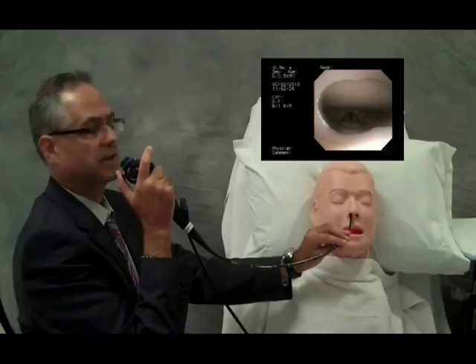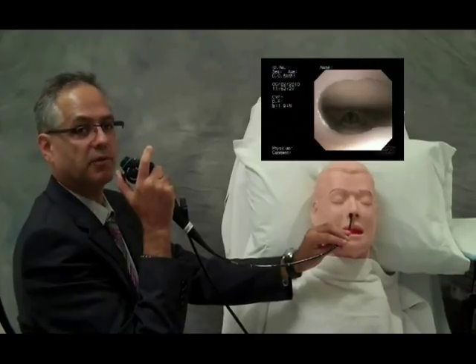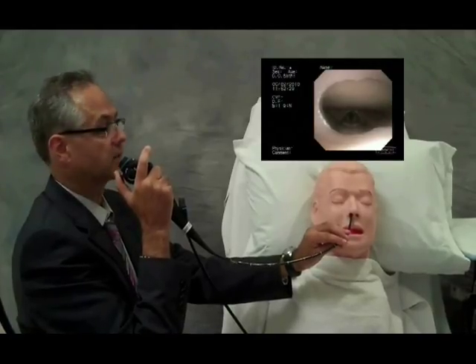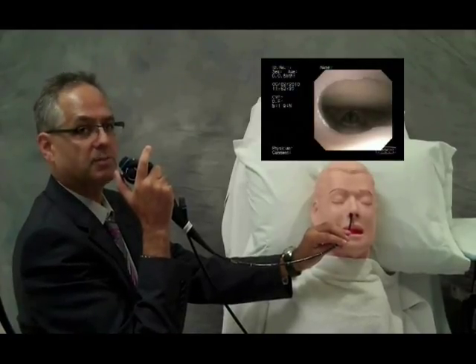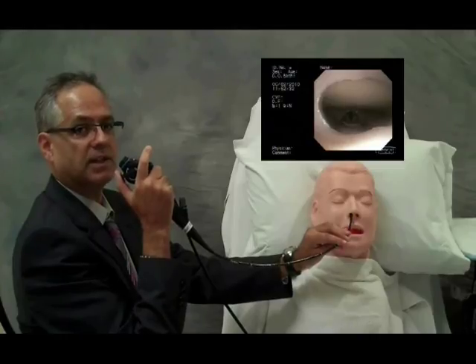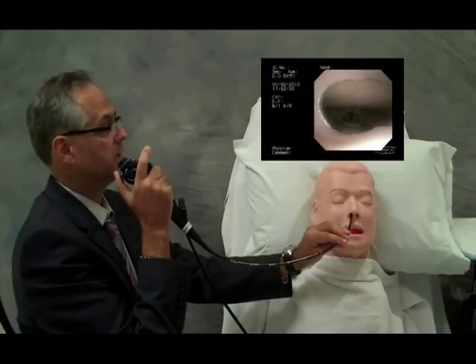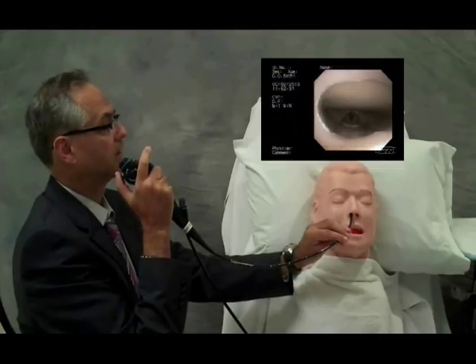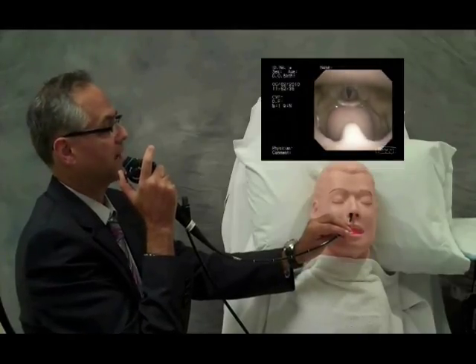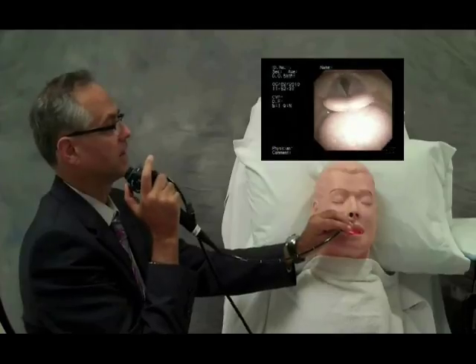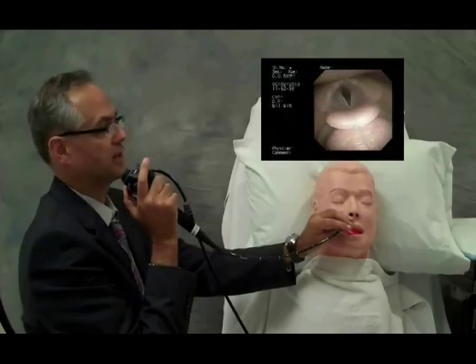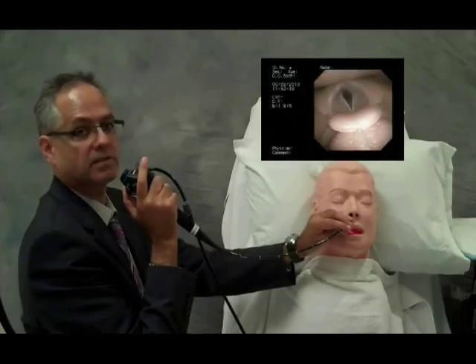Step 1 will be moving the bronchoscope from the nostril down to the larynx. Slight manipulations may be necessary to keep the scope in the midline. Pass the uvula, the tongue, and visualize the epiglottis.